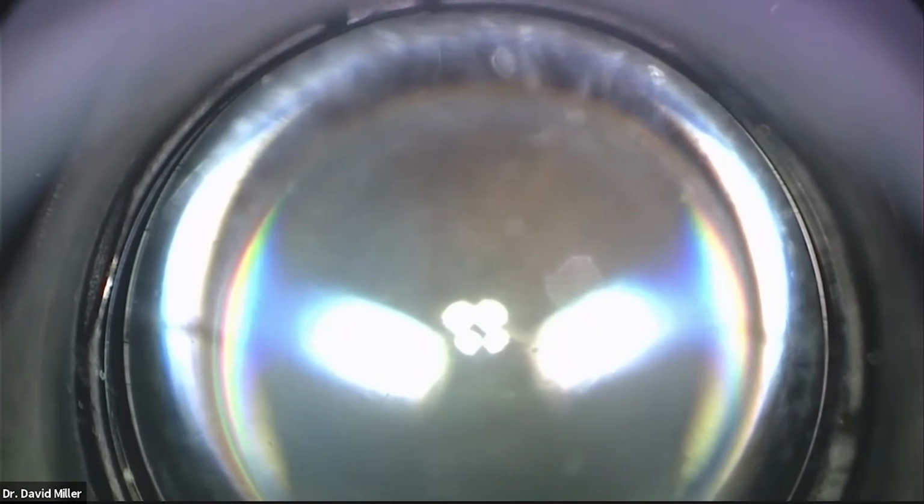Let's see, I think you better take the, give me the cautery. I'll give Mike the depressor. I'm going to take the cautery. We're going to mark that. Okay, it's 6 o'clock. Now we'll do it. Mike, I think you'll be fine right there.